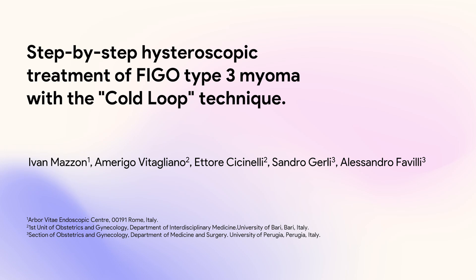Step-by-step hysteroscopic treatment of FIGO type 3 myoma with the cold loop technique.